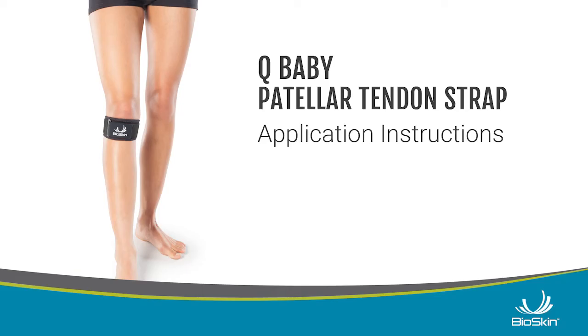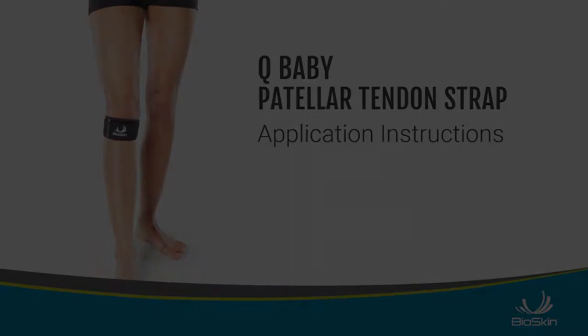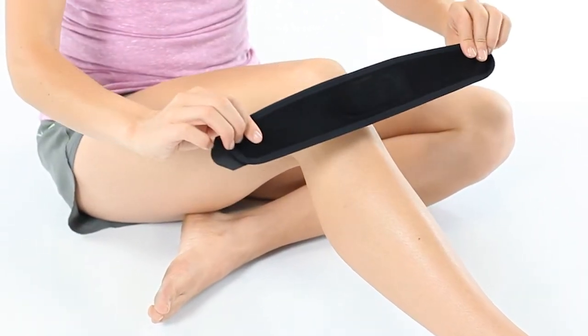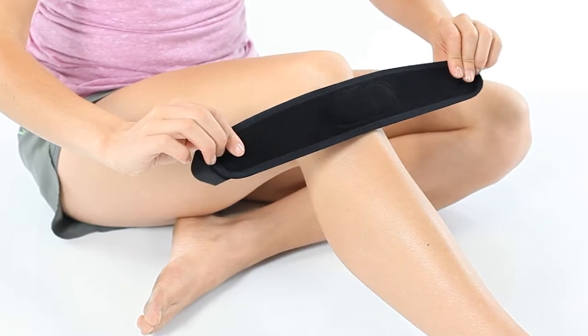Q-Baby Application Instructions. First, position the silicone buttress over the patellar tendon just below your knee joint.